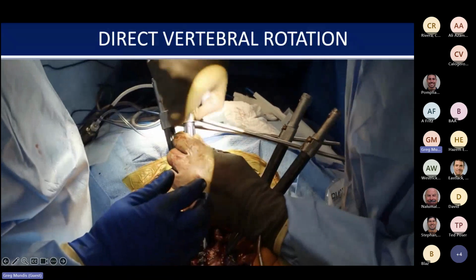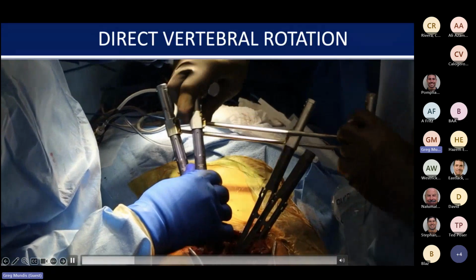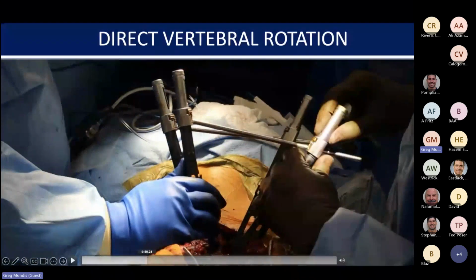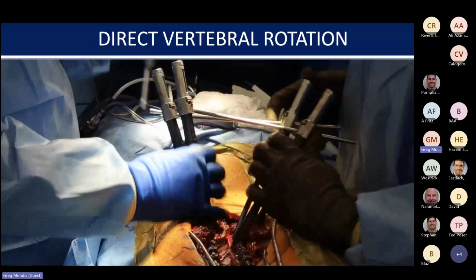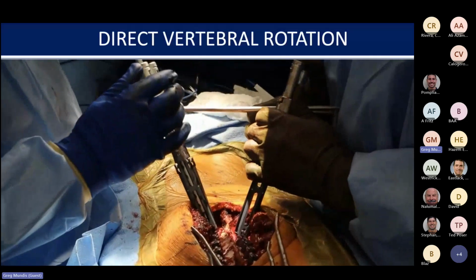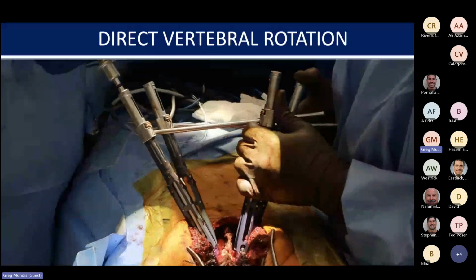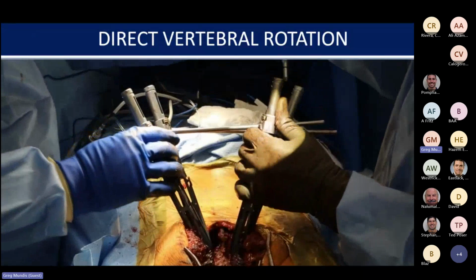The idea here is that you're going to sequentially derotate these, and it looks like I'm showing you how to do this nice and smooth. Once you clip these on, you tighten them in place, and then you're able to rotate one vertebral body relative to the other. You can see that my left hand is rotating over the top, but if you look at my index finger, I'm actually lifting the vertebrae out of the patient.